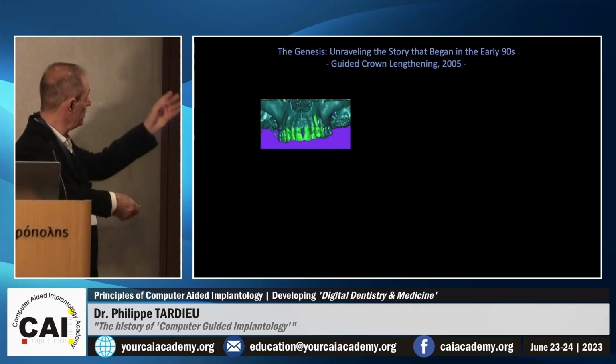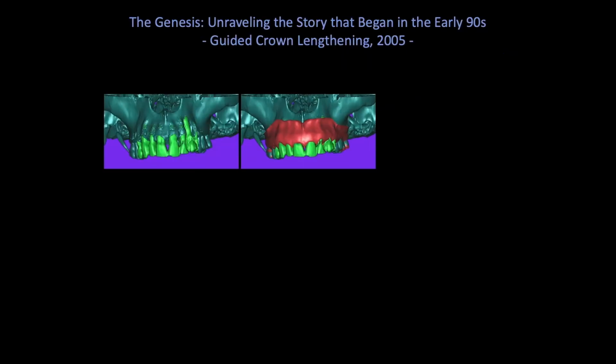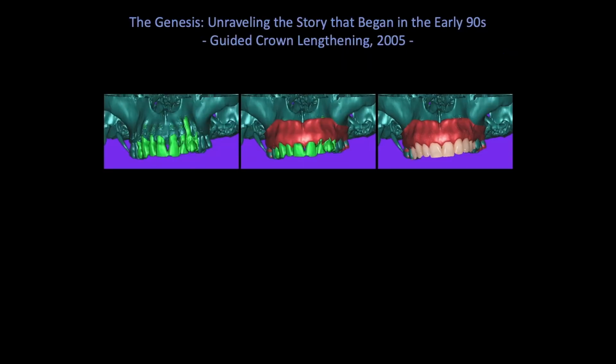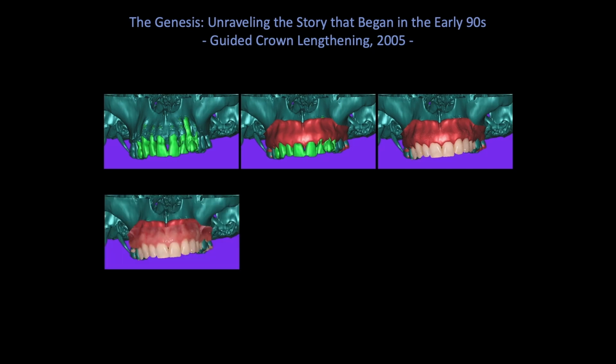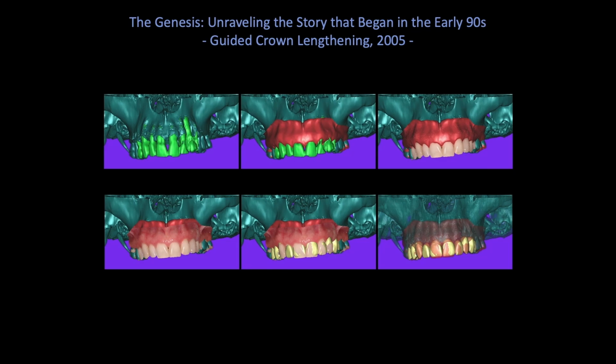And we managed it with software. You see the implant. We added the gum and added the color of the gum and of the teeth. And this was coming from Materialise at that time. We don't really use it today, but it's nice to see that we can overlay the color from the pictures of the patient. So this is that, and this is that.